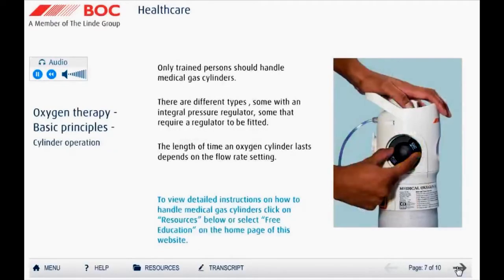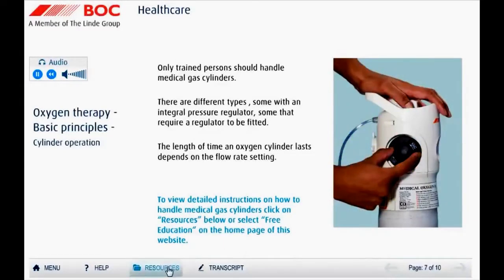Medical gas cylinders should only be handled and operated by those trained to do so. Cylinders come in a variety of different forms — some with integral pressure regulators, and others that need a separate regulator to be fitted.